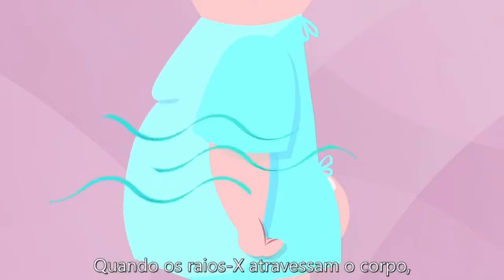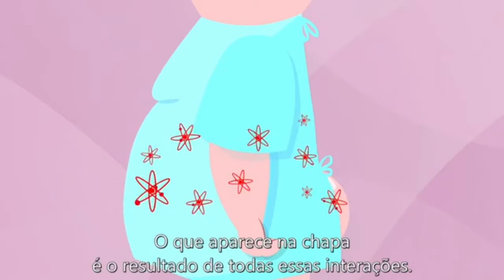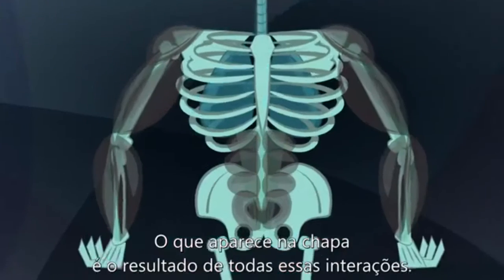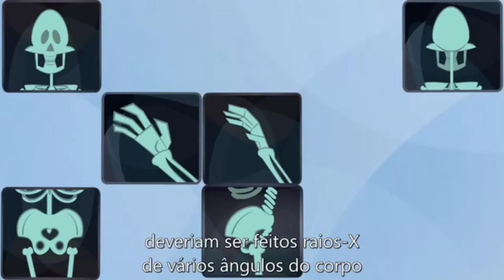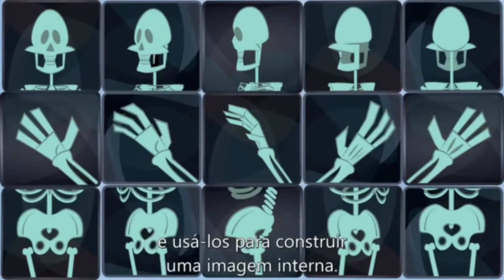When X-rays travel through the body, they can interact with many atoms along the path. What is recorded on the film reflects the sum of all those interactions. It's like trying to print 100 pages of a novel on a single sheet of paper. To see what's really going on, you would have to take X-ray views from many angles around the body and use them to construct an internal image.